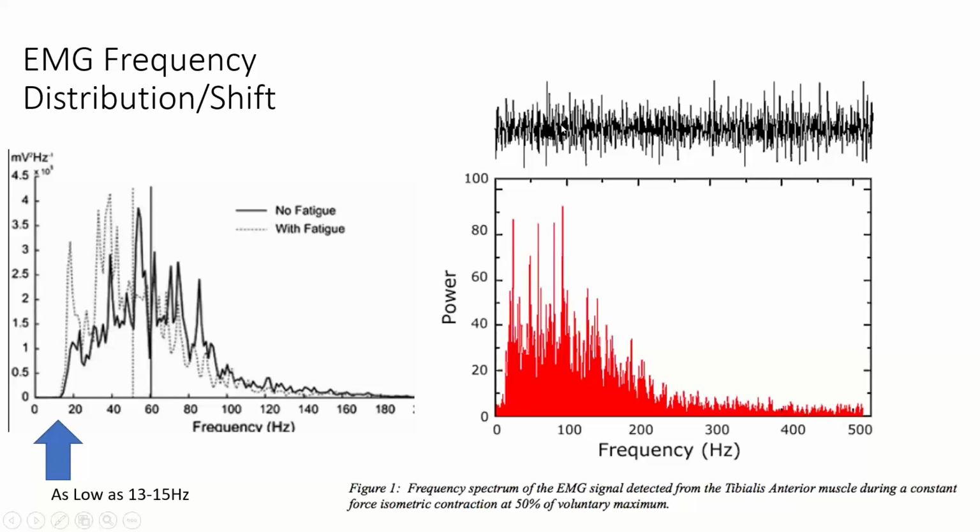But that's an almost chaotic, stochastic signal. It's so complex, it's almost chaotic. And there's a reason for that. We'll talk about that. And you can see the frequency range. The majority of it is below 200 hertz, and in fact, even more of it's below 100. And if we really get into it, as they said, it's really in the 20 to 60 hertz range.